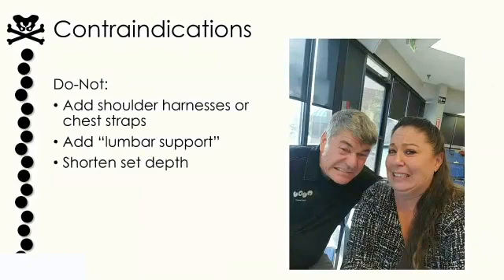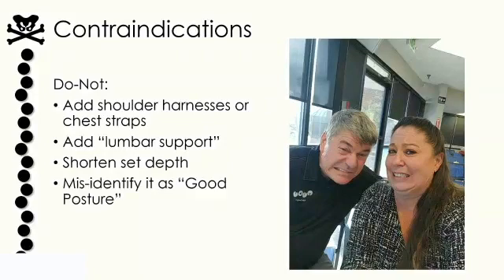As they continue to scoot back, they're going to tell you that their seat depth is too long and they want you to shorten it up. But the more you shorten it up, the more they scoot back. So we have to stop the slide and not shorten the seat depth.